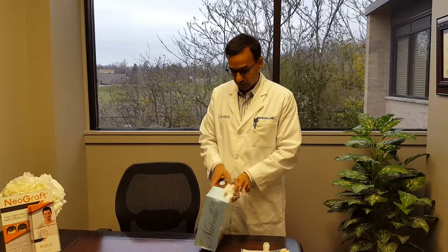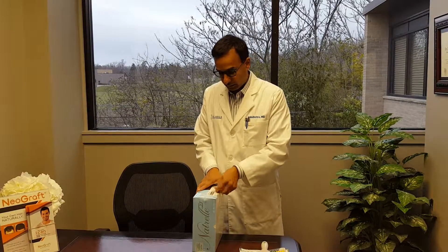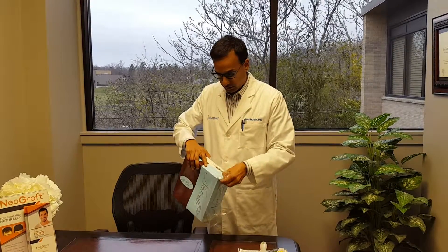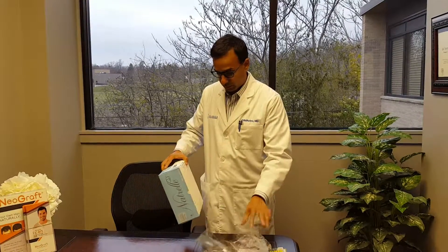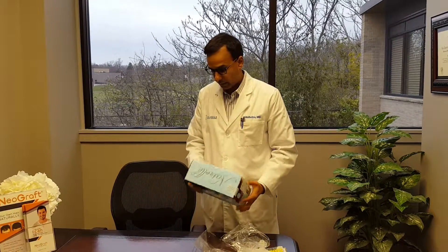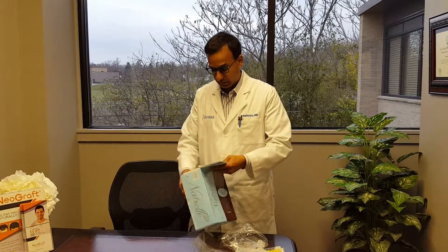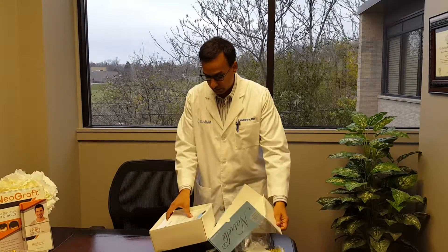This is an Allergan Natrelle implant, a silicone implant that's 457 cc's. You can see it's actually triple wrapped — there's a wrap around it, and then it comes in a sterile container.